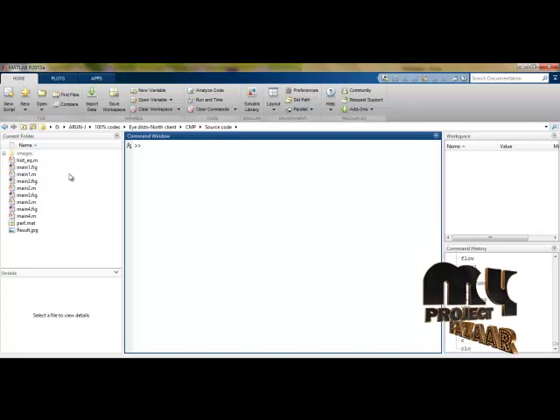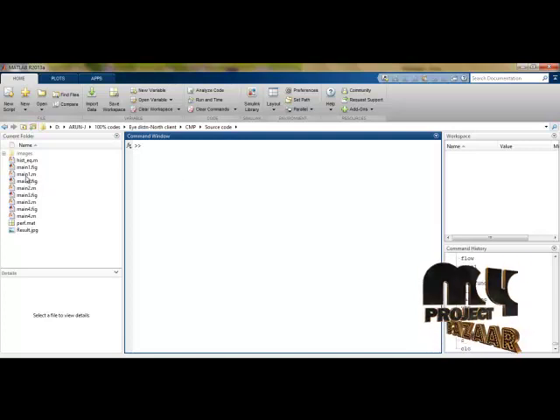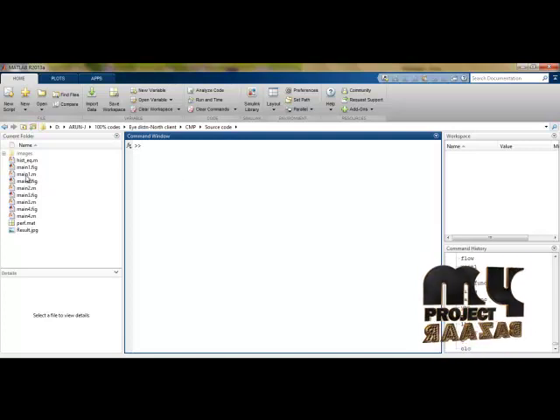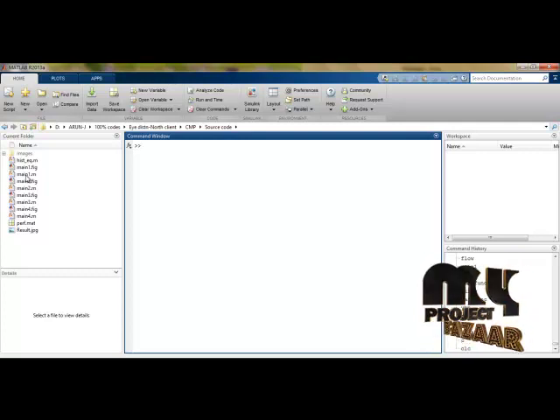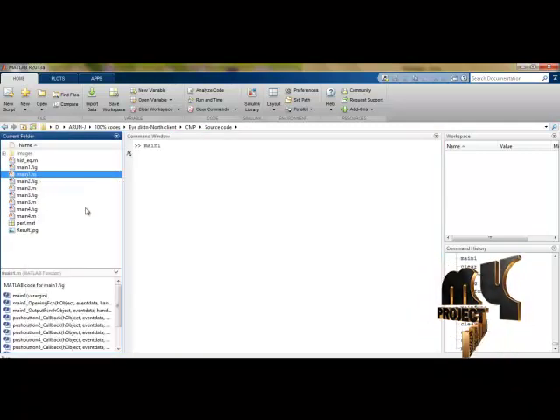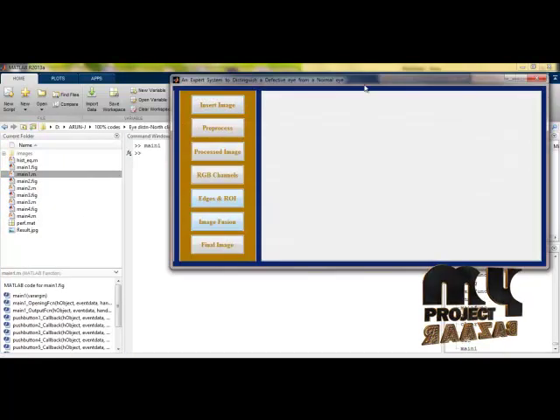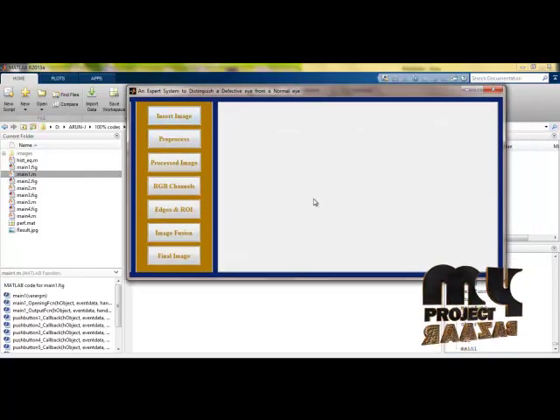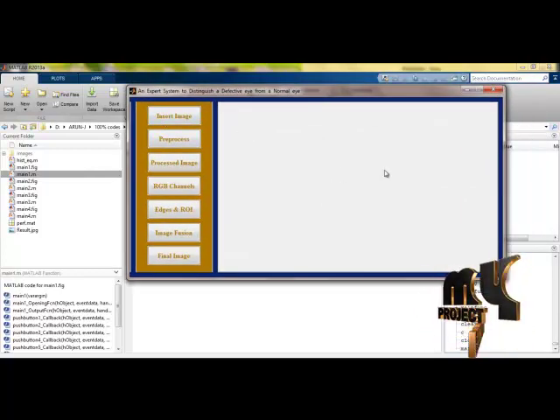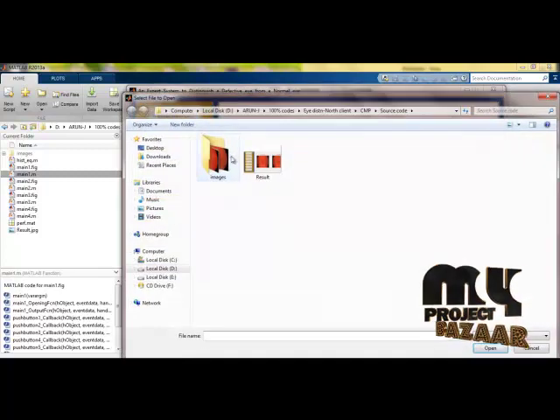To run the product, I need to select main1.m. When I run this, it will call the main1.fig interface. I have selected this and it has opened the main window. This is the main window of our process panel, and here I am selecting an image.